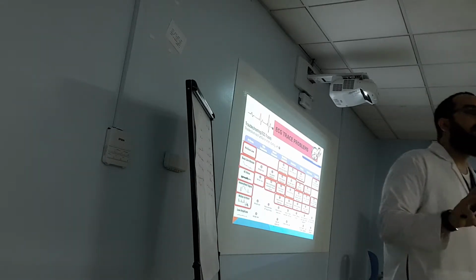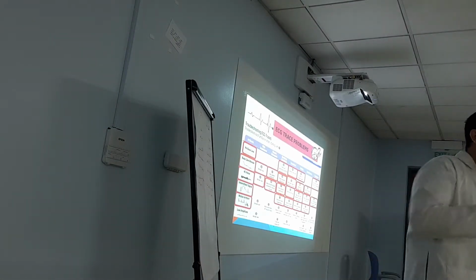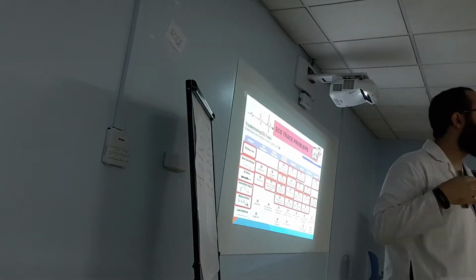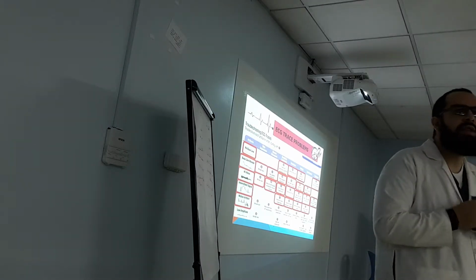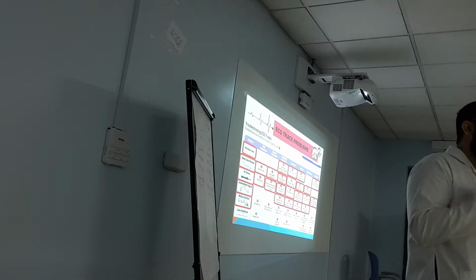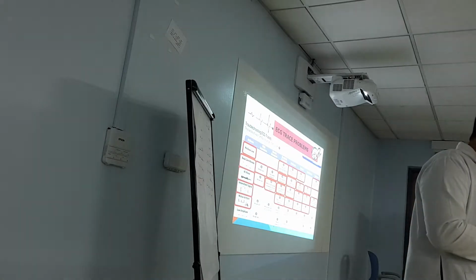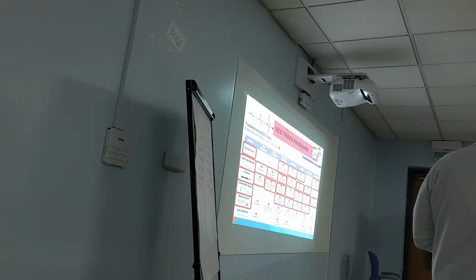Otherwise, the patient himself has shivers and you're not noticing. Maybe they're not strong shivers but very fine shivers, and you're not noticing it, but it's affecting your ECG. So try to warm the patient before doing the ECG; it will make the shiver go away. The shivers can be really strong and visible, or there may be minor muscle contractions that are not visible to your eye. So always rule out the cause of the shivers, which is fever and extreme cold. These things need to be stopped.